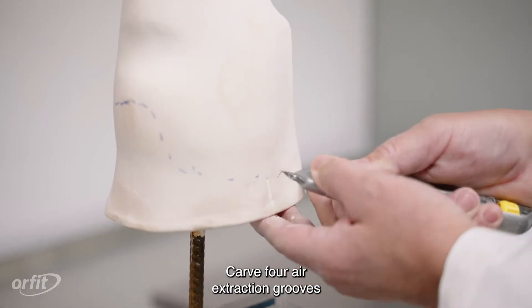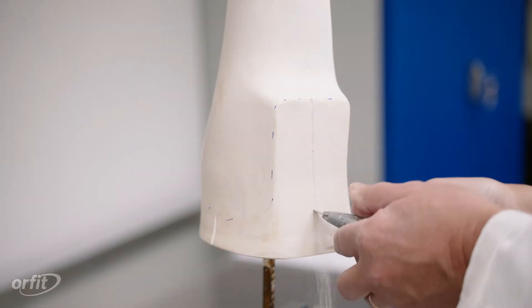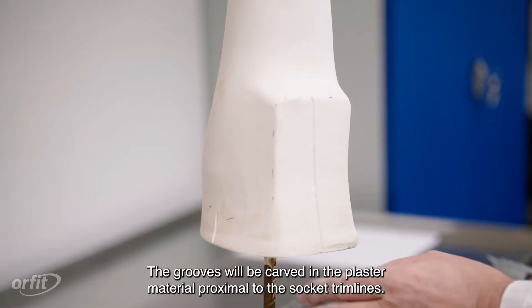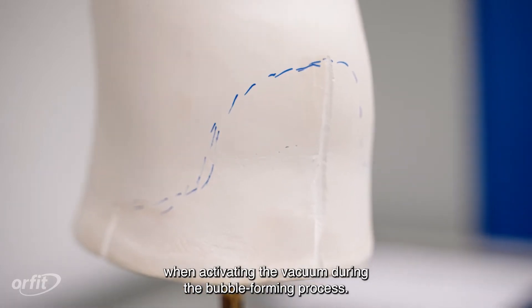Carve four air extraction grooves so that one groove is on each side — anterior, posterior, medial, and lateral. The grooves will be carved in the plaster material proximal to the socket trim lines. The purpose of these grooves is to allow the air to escape when activating the vacuum during the bubble-forming process.